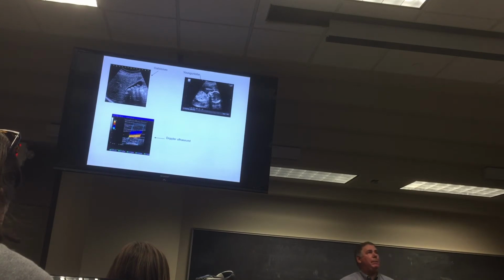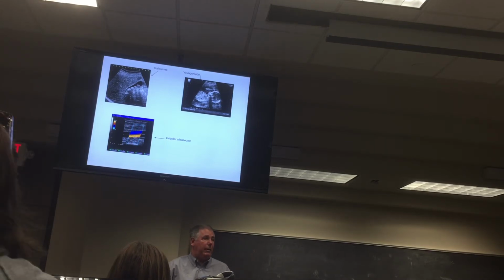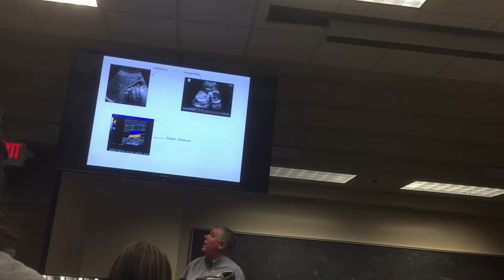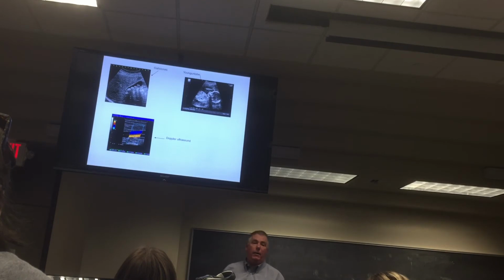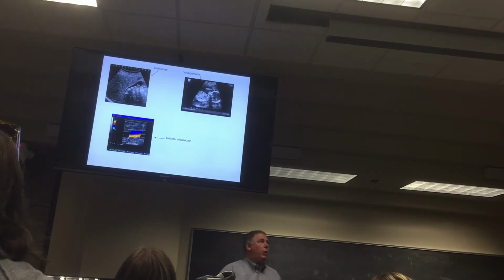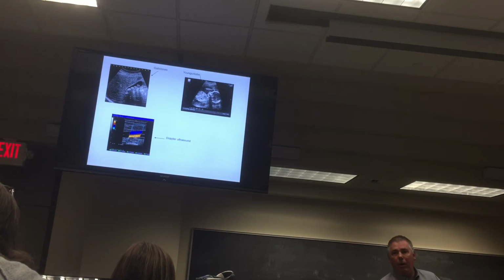If you look at some examples here, here's the plain ultrasound of the gallbladder. You never use contrast with ultrasound, by the way, showing the 4 rocks that are in there, lined up pretty in a row. Because these things are dense, you look at the shadow behind them. That'll help confirm that, yes, indeed, those are gallstones. Here is a kid, obviously. And here's an example of a Doppler ultrasound showing the 2 vessels. I don't know where that is, but maybe the popliteal area. One of them is the popliteal vein, one of them is the popliteal artery.